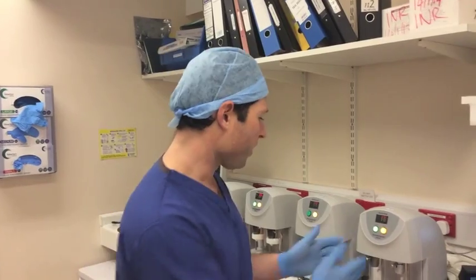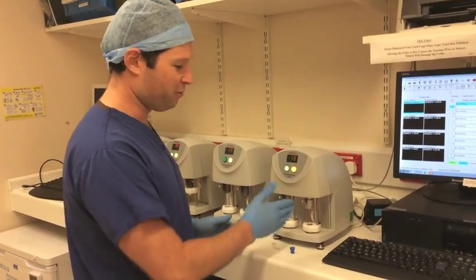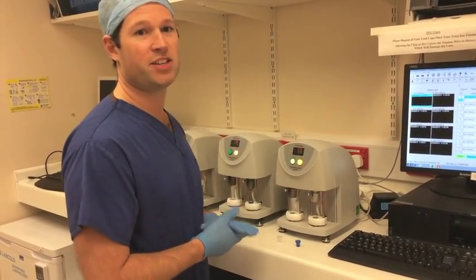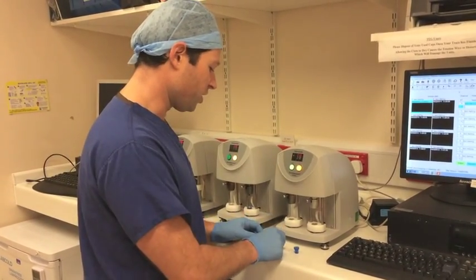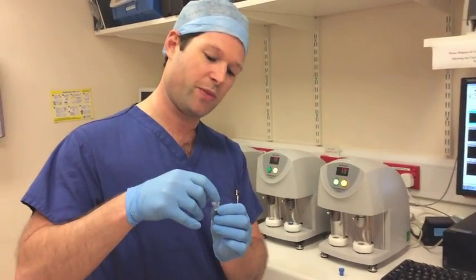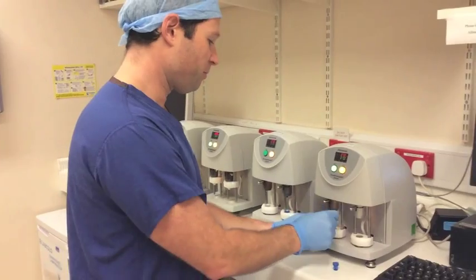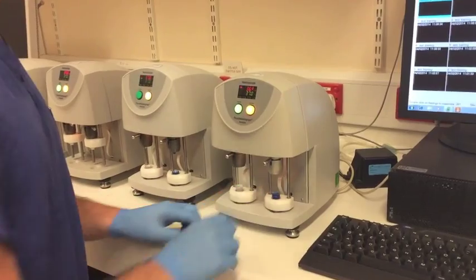Once you've collected the equipment that you need to run the TEG, the first stage is to load the cups into the TEG machine. We have our TEG analysers here. I've got my two cups, and we always put the heparinase cup — the blue cup — on the right-hand side, just for ease of monitoring our results. We take our cup, which consists of two parts: there's a cup and a pin that fits into it, and this is what gives us our trace. We put both parts into the bottom of our machine.